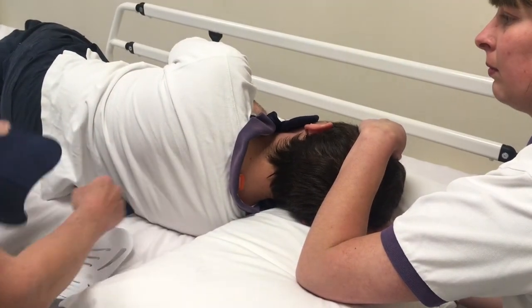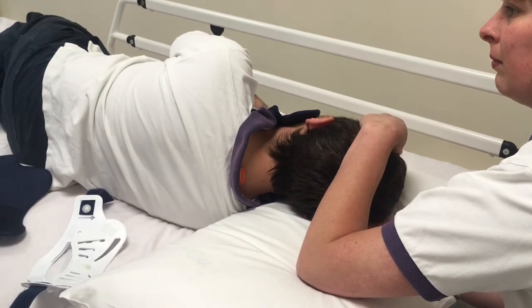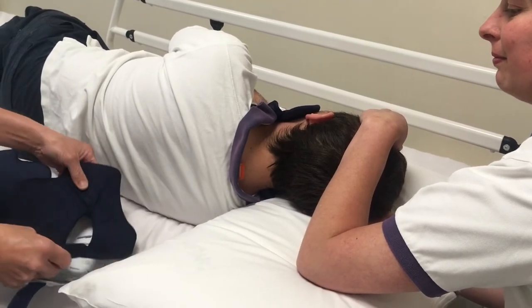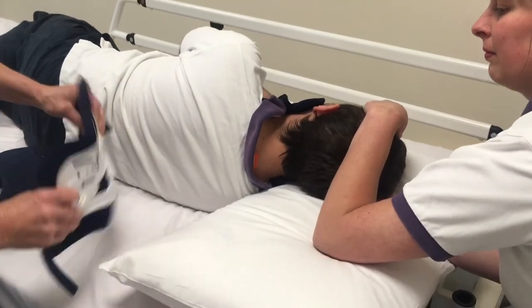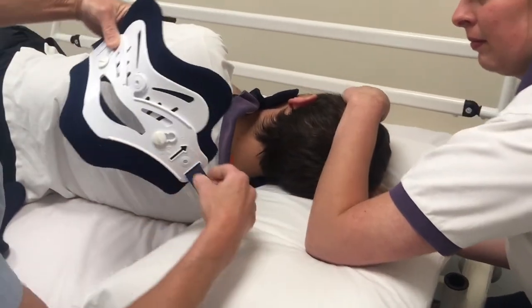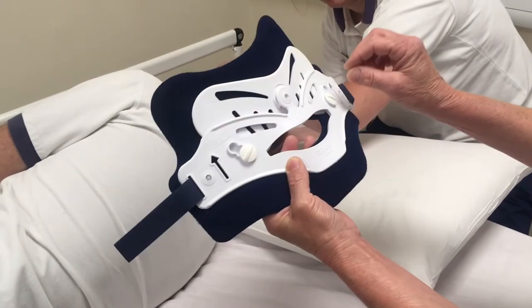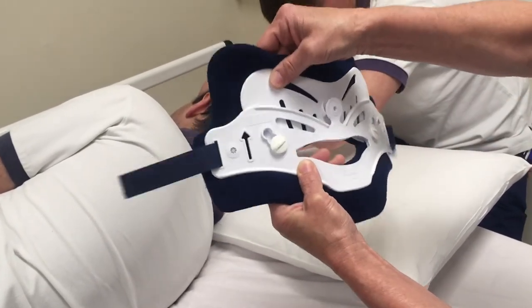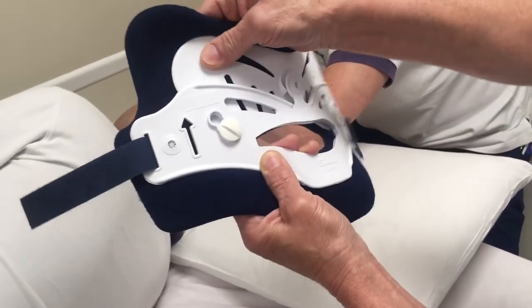Then change the liners on the fresh one, making sure that the soft side of the liner attaches to the collar fully. It's important to make sure that the buttons which stop the collar moving are in the locked position, as opposed to unlocked.